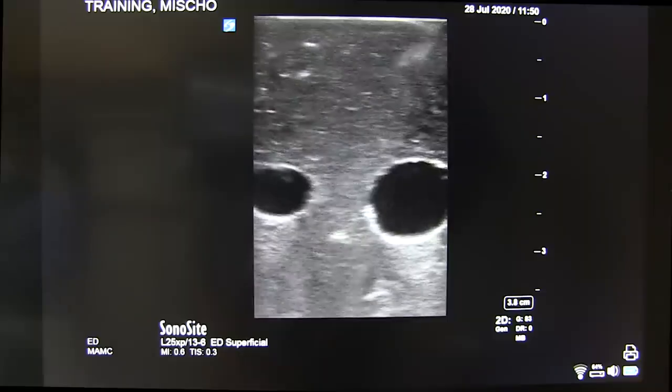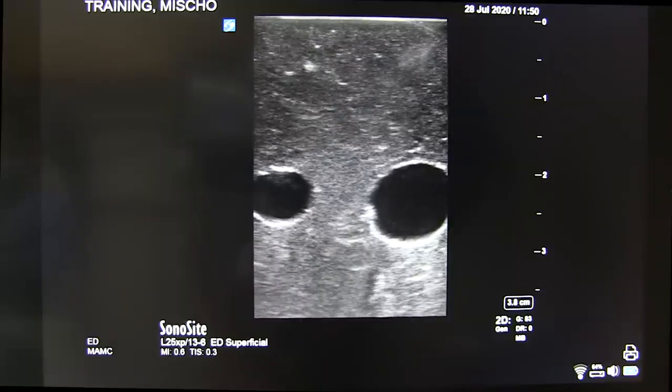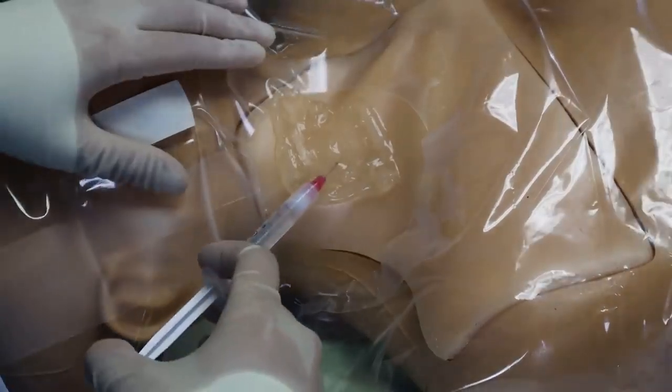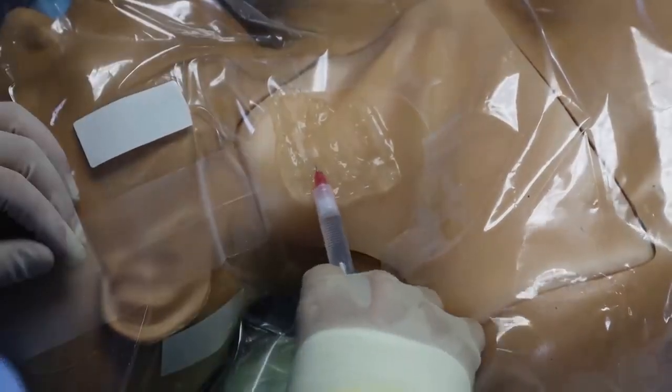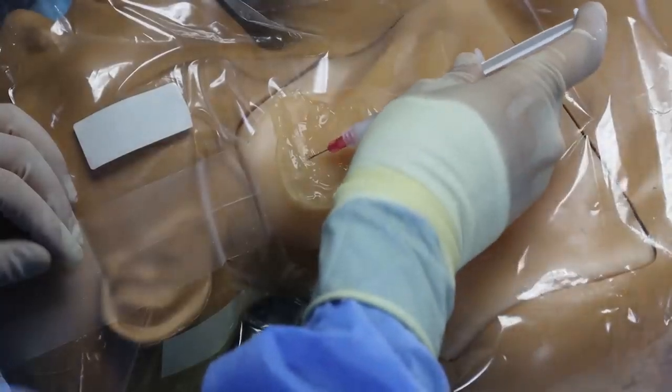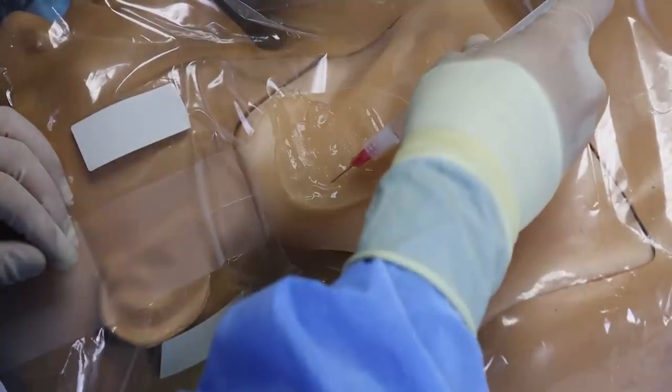Next, I slap some sterile gel onto the patient and have a look with the probe again. So let's see. Yep, looks like my sight. Having confirmed where I plan to make the puncture, I inject lidocaine subcutaneously. It's important to remember that you will be sewing the line in. So you also need to inject where you anticipate the suture needle will be passing.